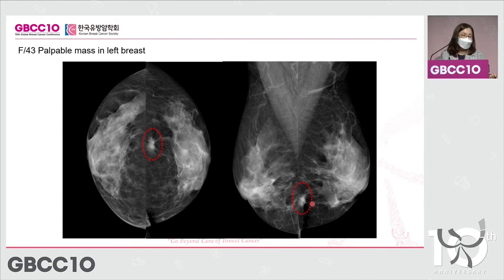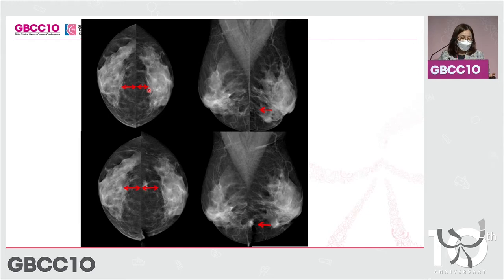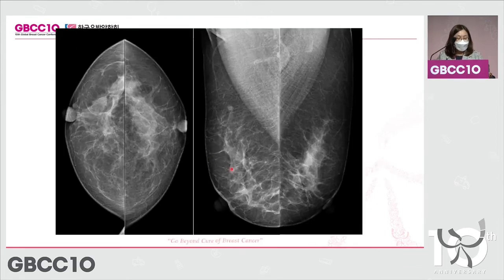In some instances, through a routine workout, you might miss these areas where the lesion is present. So it is very important to conduct a right mammogram. So these areas, the deep portion, and the lower part of the breast had a lesion included in this image, as you can see.